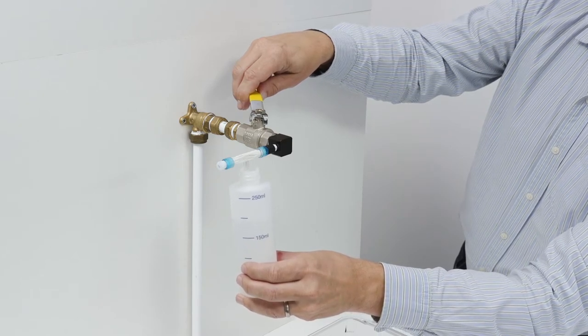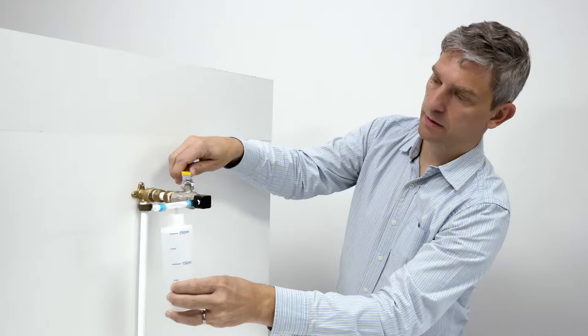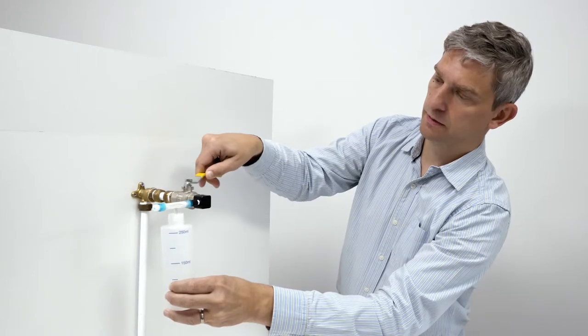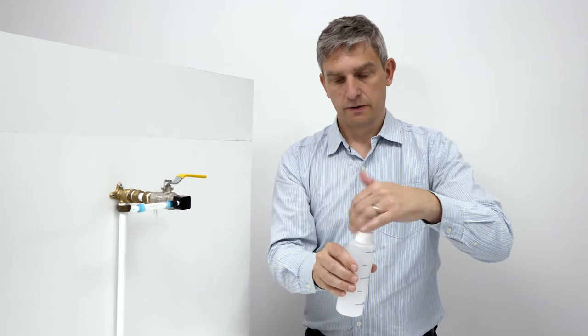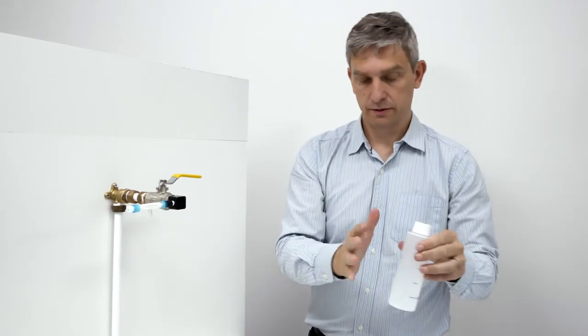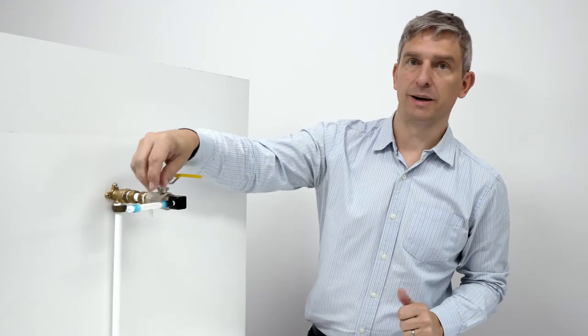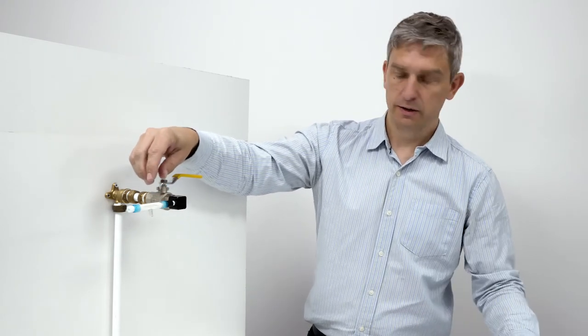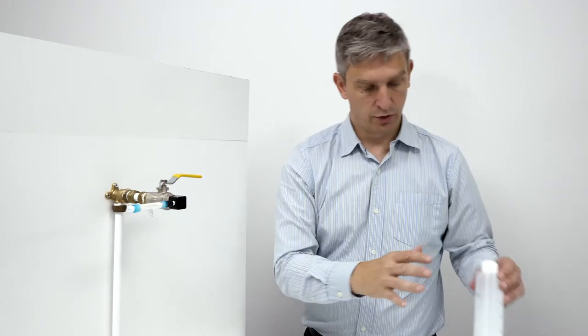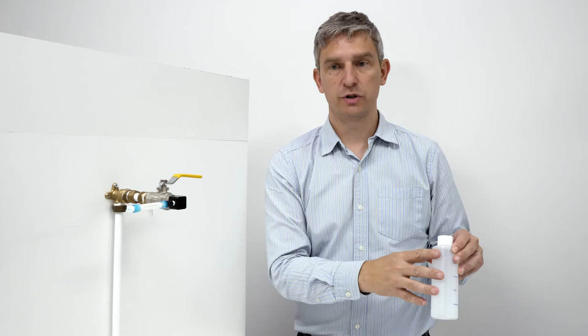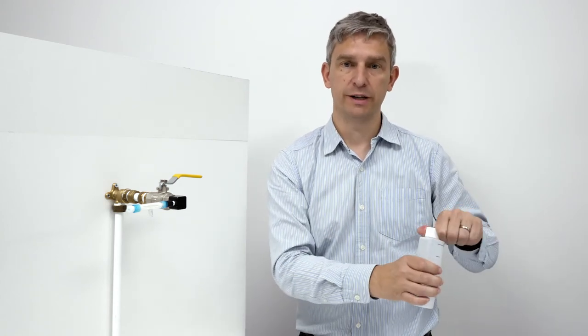Once it reaches the top, we can close the valve. What we've done here is we've passed this 250 milliliters through the filter, and any Legionella bacteria that were present in the sample have now been collected into the filter. This water here can be disposed of—it's no longer required—but the bottle can be reused for the other tests within the test kit.